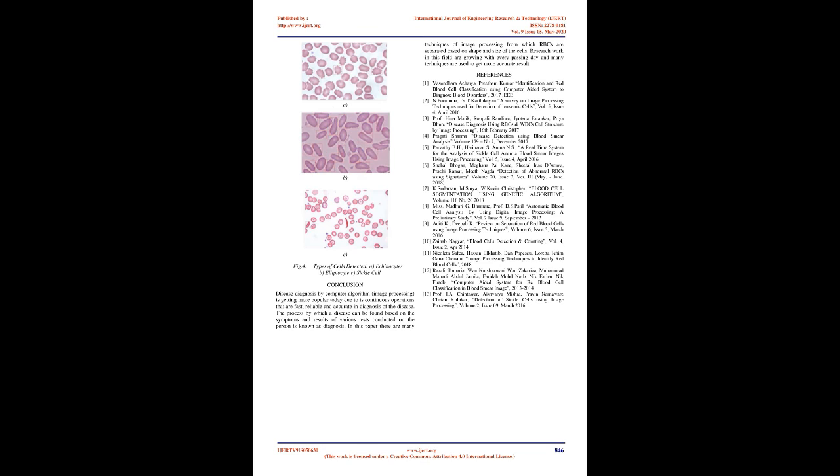In 3, cell counting depends on proper recognition of cell. The accuracy of the used algorithm depended on the camera used, size of cells, whether or not cell touching and illumination condition. In 5, the system was only tested for 2 databases, and may have different results in different databases. More properties of the developed system have to be investigated and should be tested on more databases. However, databases are difficult to obtain. Trained and experienced expert services are also required to evaluate the quality of diagnosis made by the system. Results of normal and abnormal cell classification is shown in Figure 3 12.